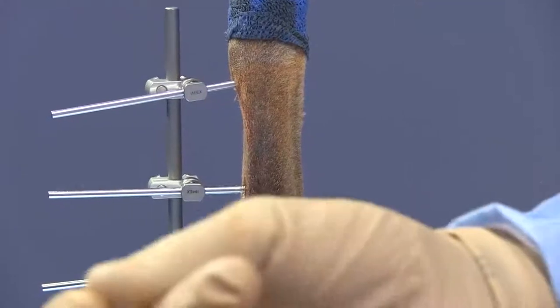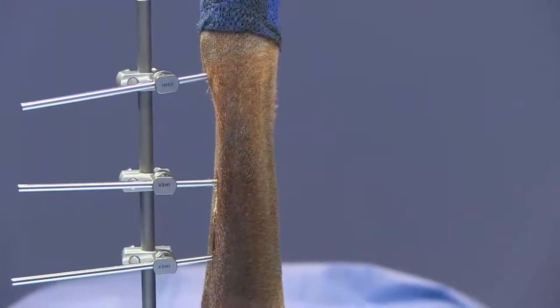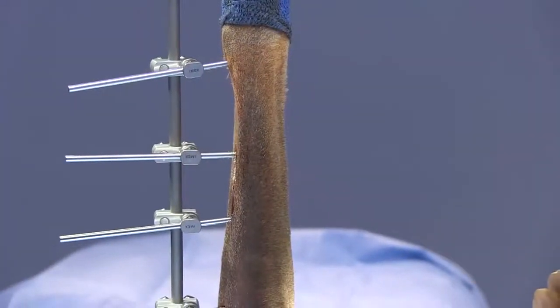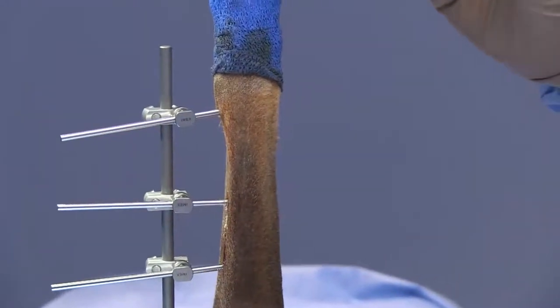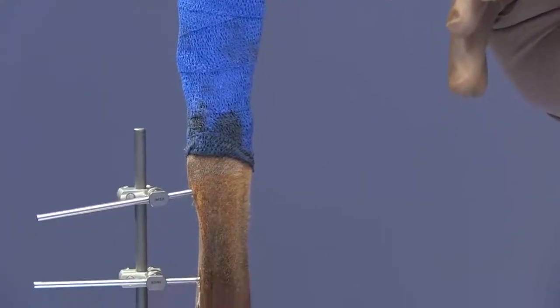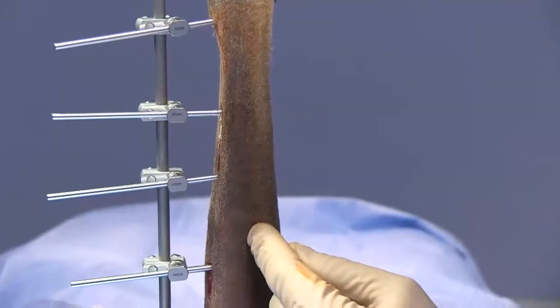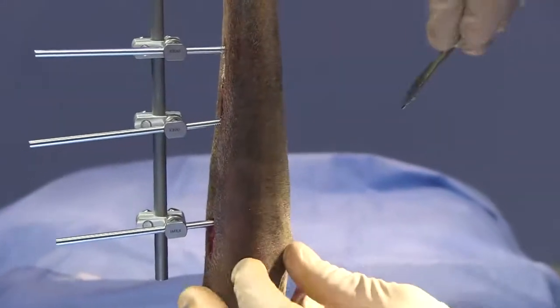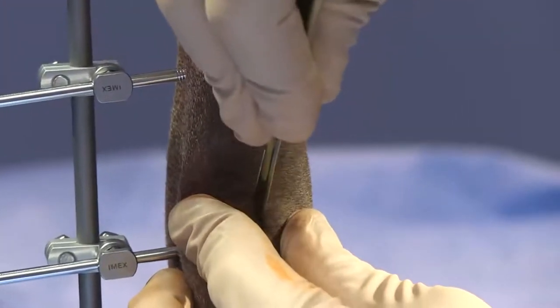I'll go ahead and make the releasing incision on this side. The advantage of having the initial construct already applied is that I know where my joints are, so I don't necessarily need to use the feeler needles — but use them if you have any concern. What I don't want is to have those pins at all close to my pins on the opposite side, so I'll make my releasing incision in an area where I'm at least five millimeters to a centimeter away from those other pins — and in this situation I can.